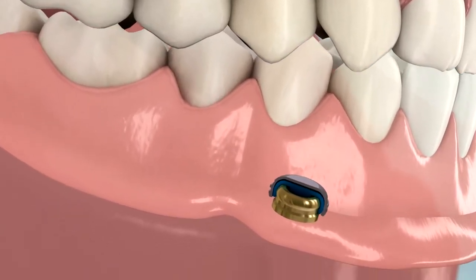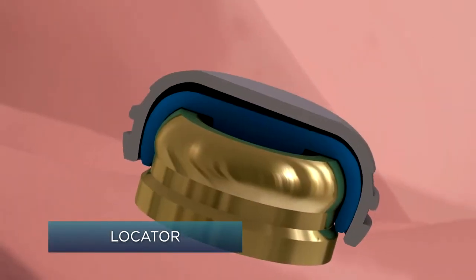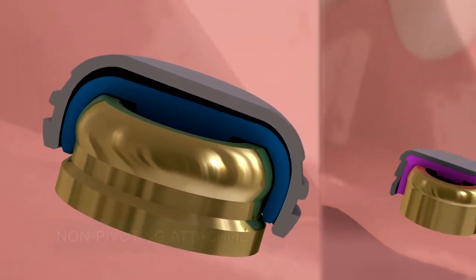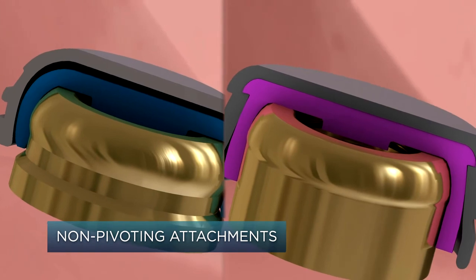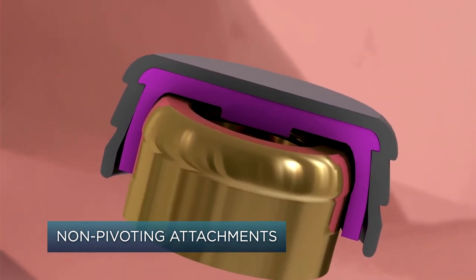This provides unmatched resiliency, allowing patients to chew normally without any worry of dislodgement or discomfort. Compare this with attachments that don't pivot. Without the pivoting action, the over-denture is locked in a static hold. As the patient is chewing, the attachment can easily disengage because of the opposing forces of occlusion.